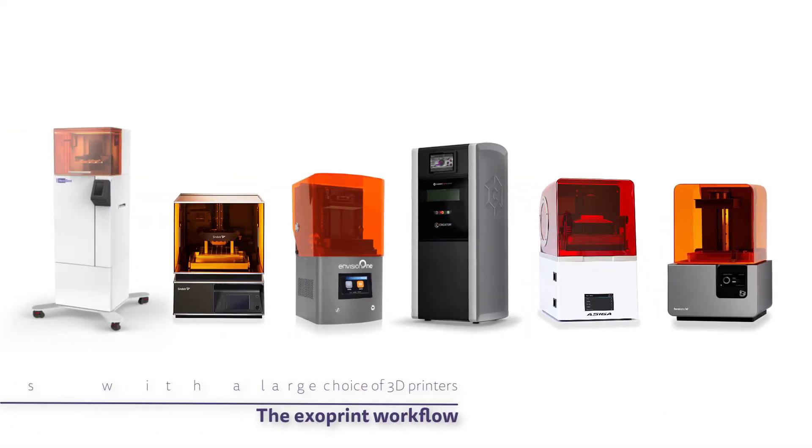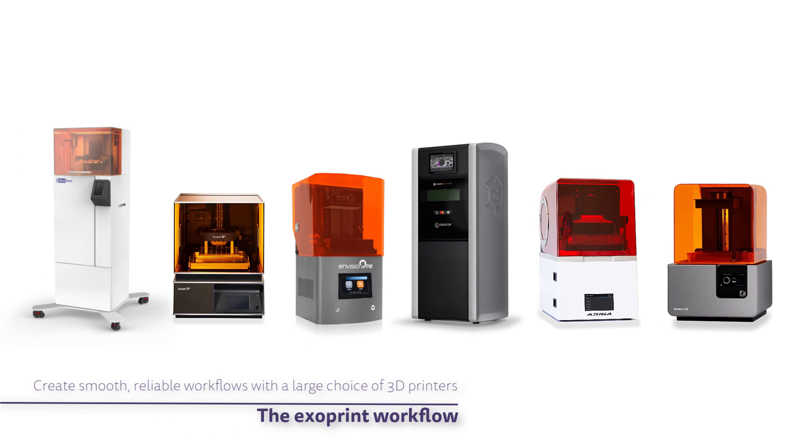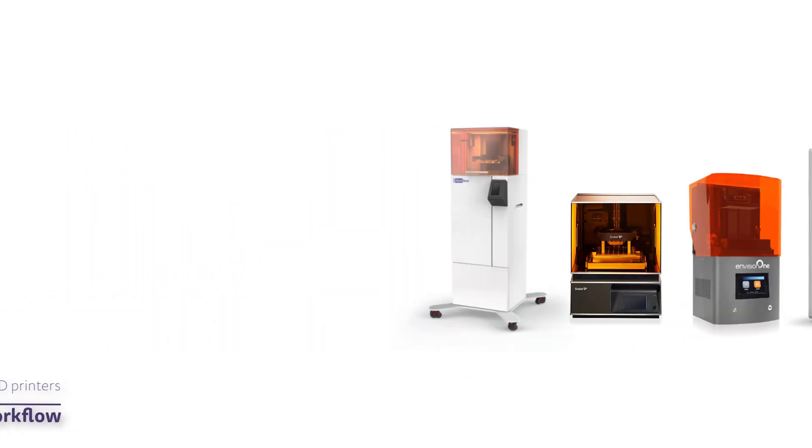The goal of ExoPrint is to create smooth and reliable workflows with a variety of 3D printers, following ExoCAD's approach of being as open as possible.